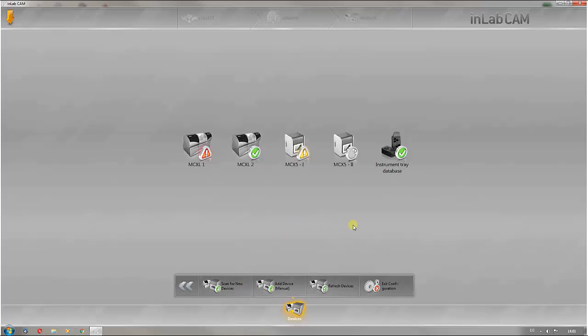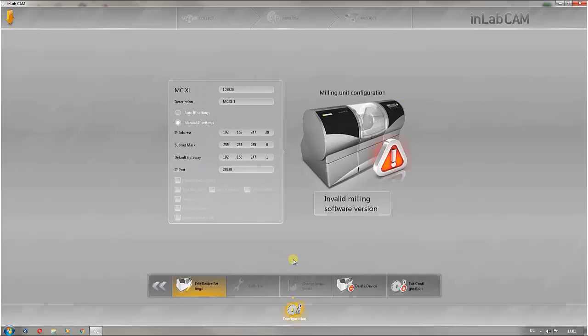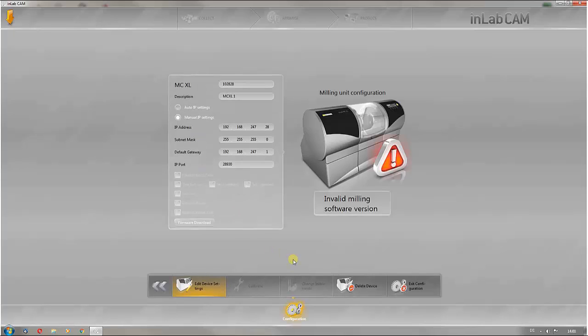New for the InLab CAM software is the fact that the firmware updates are no longer installed on the mills automatically. The corresponding mill must be selected for installation of the firmware update and the downloading of the update is activated via this button.